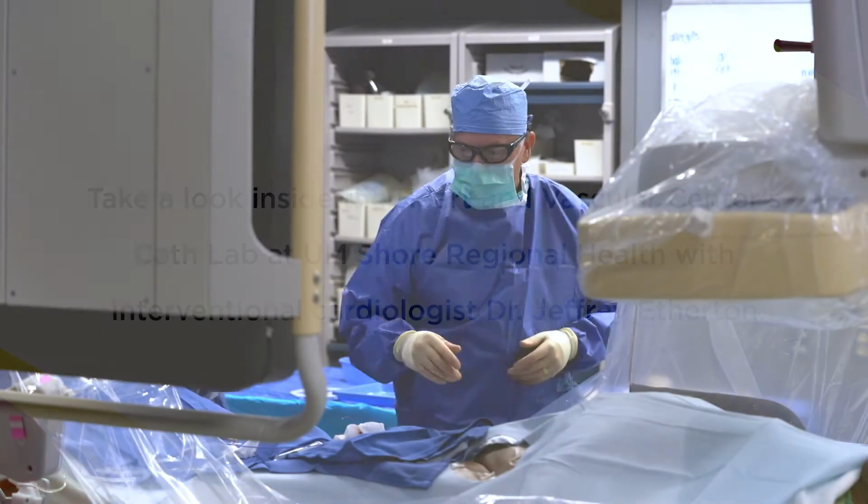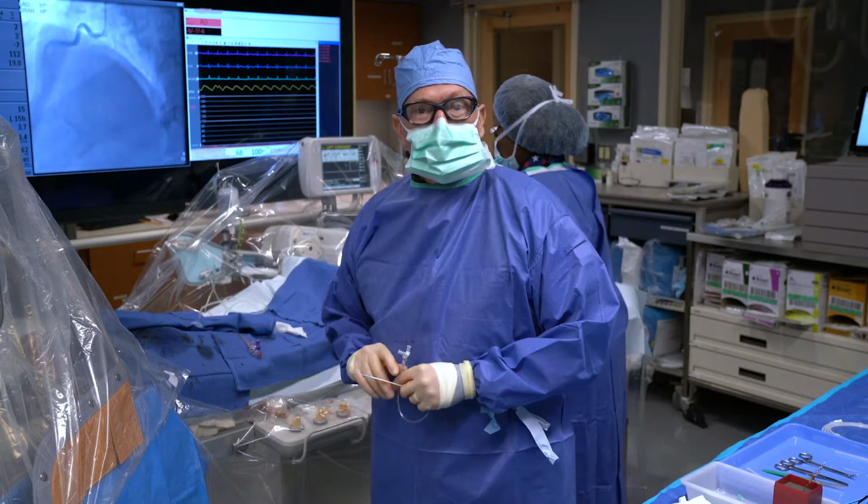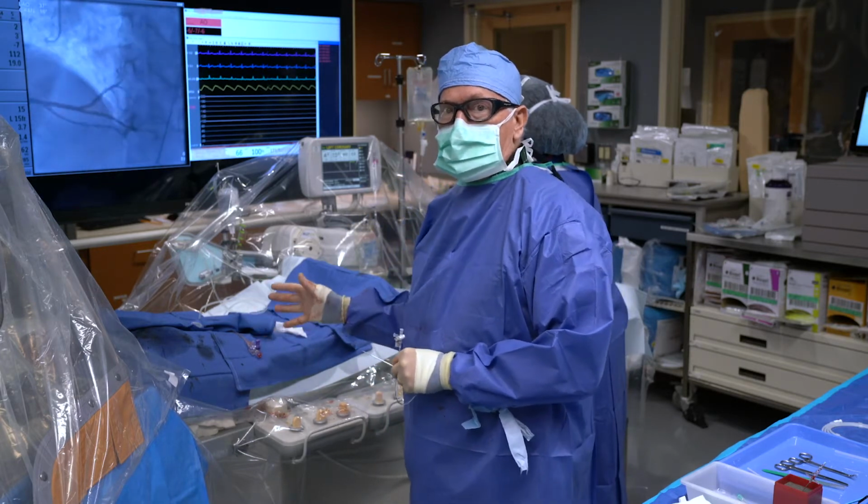Welcome to the Cardiac Catheterization Laboratory here at University of Maryland Shore Regional Health in Easton. And today we're going to be performing cardiac catheterization procedures.